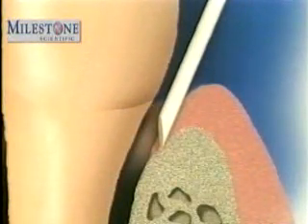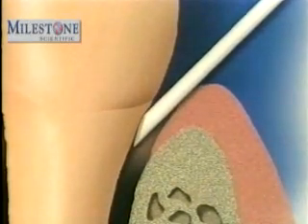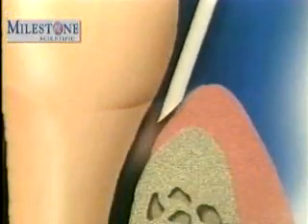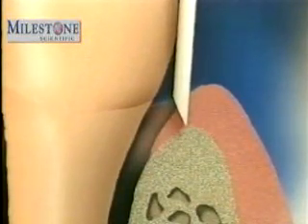The needle not contacting the tooth. In this situation, the injection will be much more painful for the patient. The needle should be hugging the root surface throughout the entire injection. If the needle bevel is not facing the tooth, it may become occluded with bone as it's advanced. If the needle bevel is not kept in contact with the root, the needle tip may come into premature contact with the crest of bone.